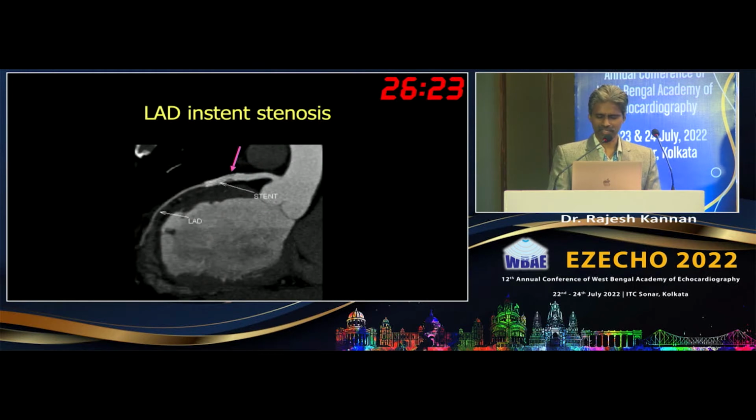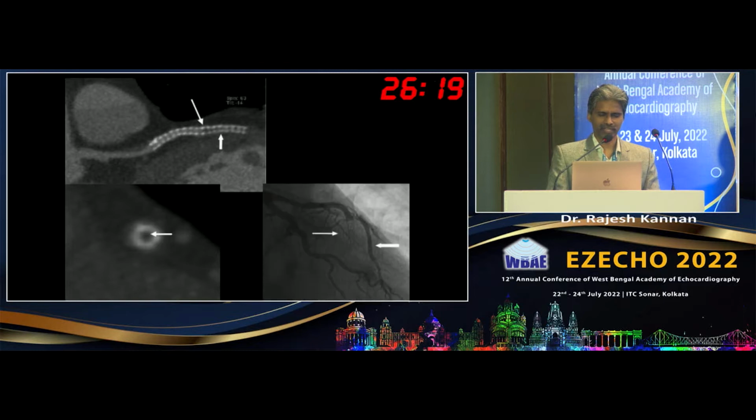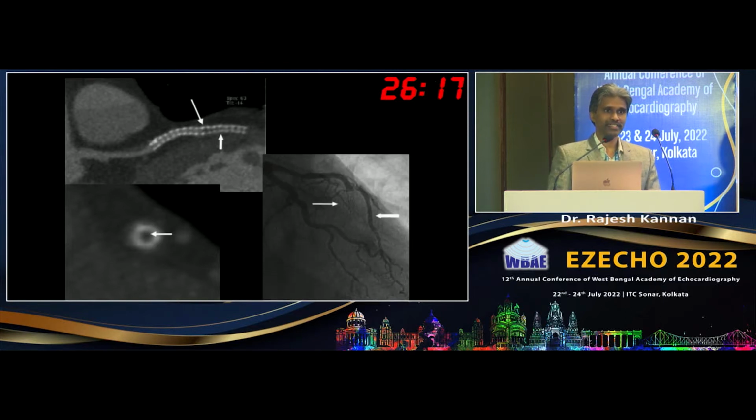Again, another case of LAD in-stent stenosis, different types of occlusion. And just by looking at the distal vessel, you won't be able to say whether the stent is patent or not. You have to look at the lumen inside the stent.